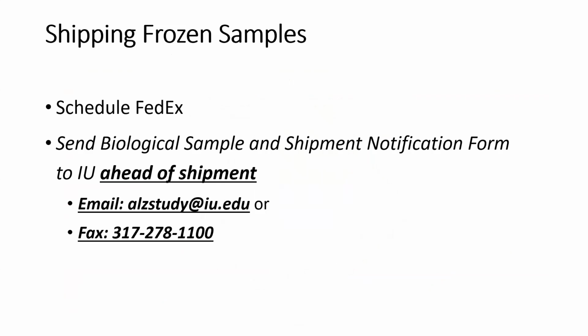And we do ask you to schedule FedEx and send the biological sample and shipment notification forms to us ahead of shipment. You can fax or email this to us at the provided number and email.